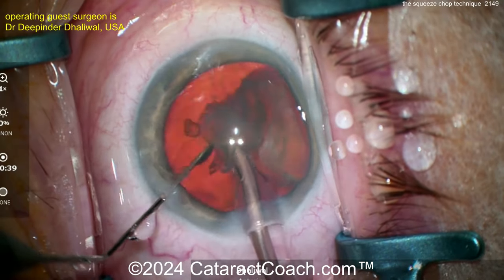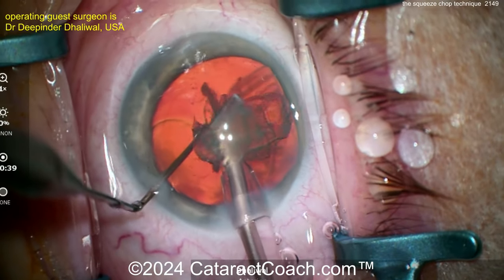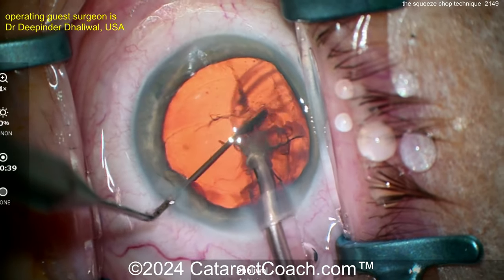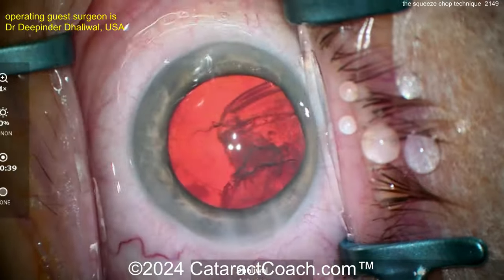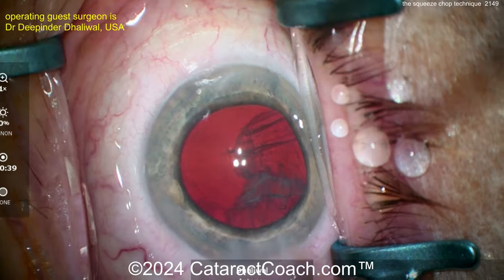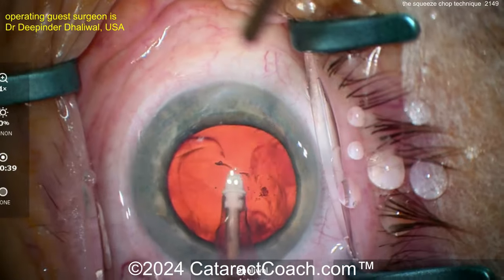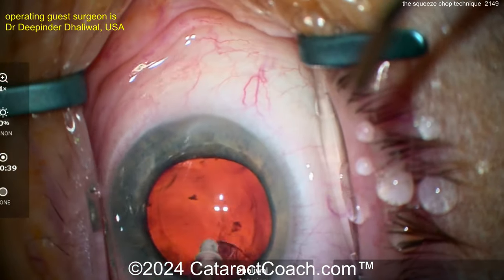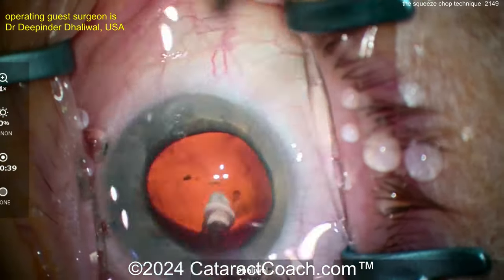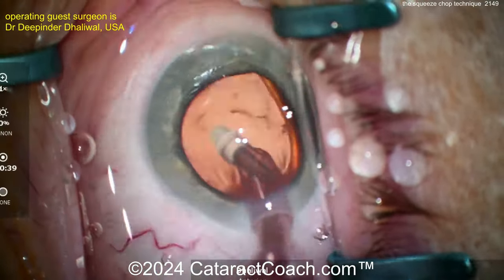Really nice technique — something to consider if you're having trouble learning a regular phaco chop. Try the squeeze chop technique. Go back and listen to that CataractCoach podcast — you'll be amazed, learning about LASIK in children and even acupuncture. Let's finish up the case at high speed — cortex removal — looks like a really nice case. The advantages of squeeze chop: no time constraint, no worrying about whether you have enough vacuum or holding power.